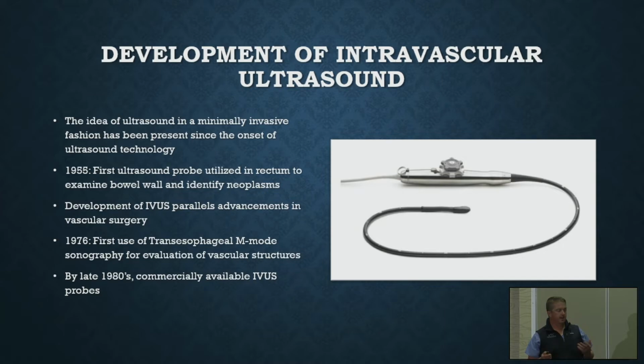The first endovascular aortic stent graft was placed in 1991 by Parodi, and catheters started to come on the market for intravascular ultrasound not too long after that to treat advanced arterial pathology, especially in the aortic systems. I think the first thoracic stent graft was placed around that year as well. And so they started to use it more and more for that type of pathology. We use it tremendously in treating complex aortic dissection work, aortic aneurysm work, things like that. They were large bore catheters, but they've miniaturized them over the years. And now they're kind of a staple in our practice.